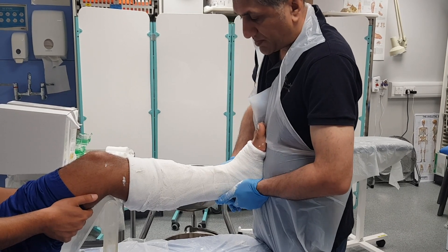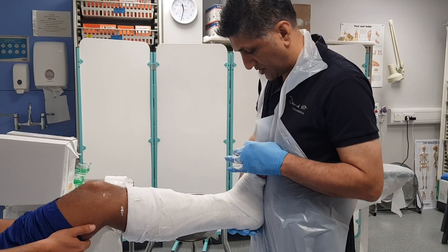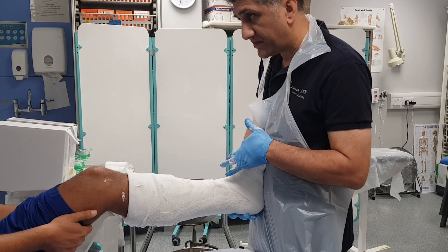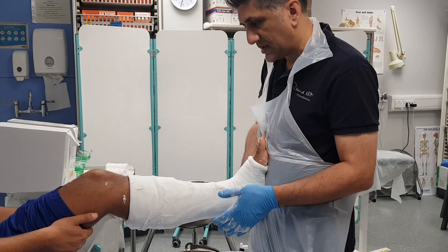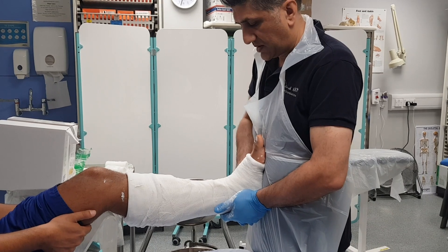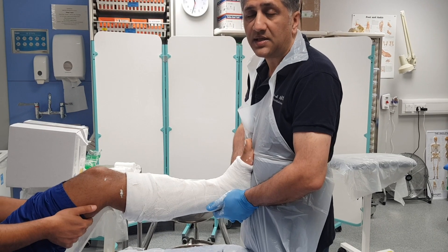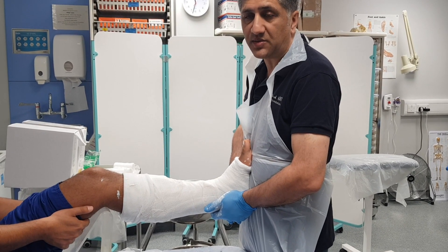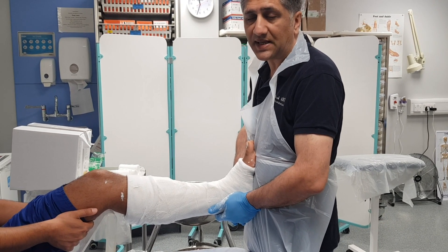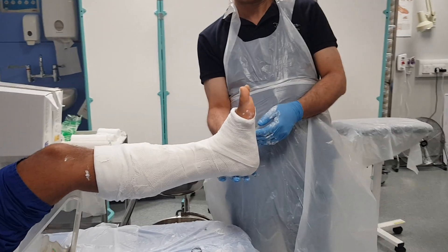My plaster hasn't quite set, but when it has I'm going to check for capillary refill and sensation — checking for pins and needles. After it's set I'm going to send him back for another X-ray to make sure I haven't made the position any worse and that there's no risk to the skin underneath from a subluxed ankle. The foot is nicely at 90 degrees.